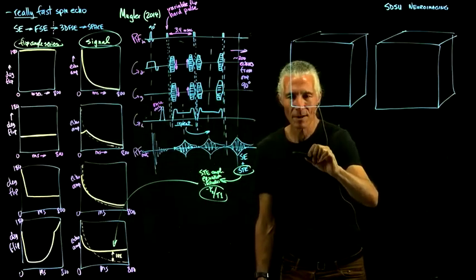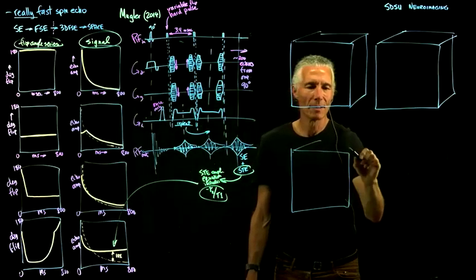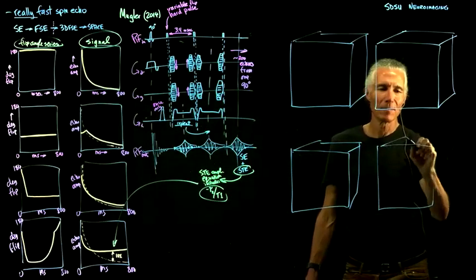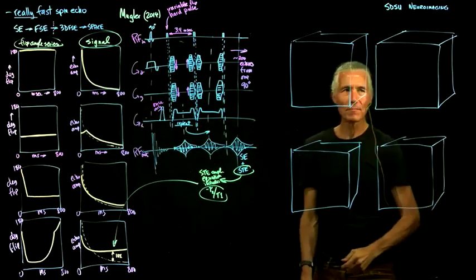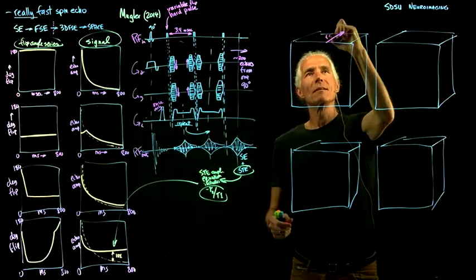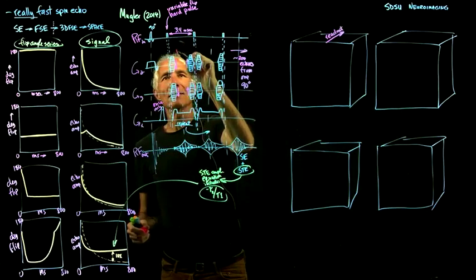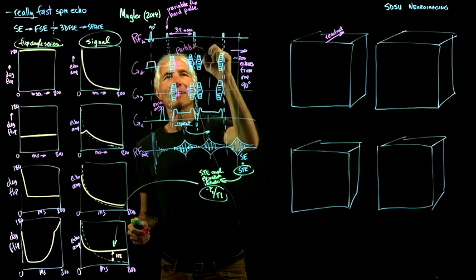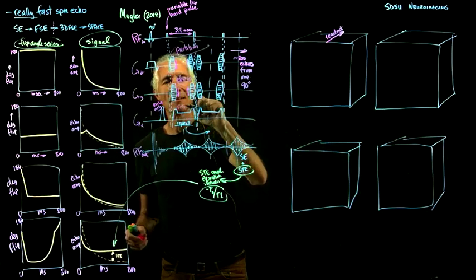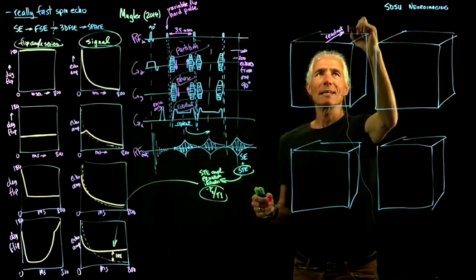I'm going to draw it for a more proton density weighted one and a T2 weighted one. So the top one will be the T2 weighted one. So this is our three-dimensional K-space that we're collecting. And so what are the axes? So this direction is the readout. So this guy is partition, and phase. And this guy is the readout. So that's the KX direction.